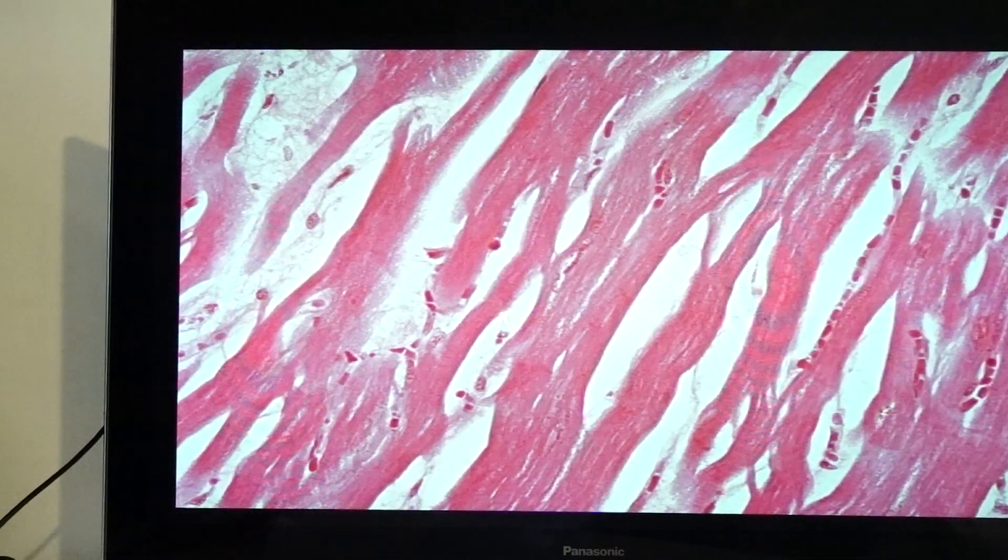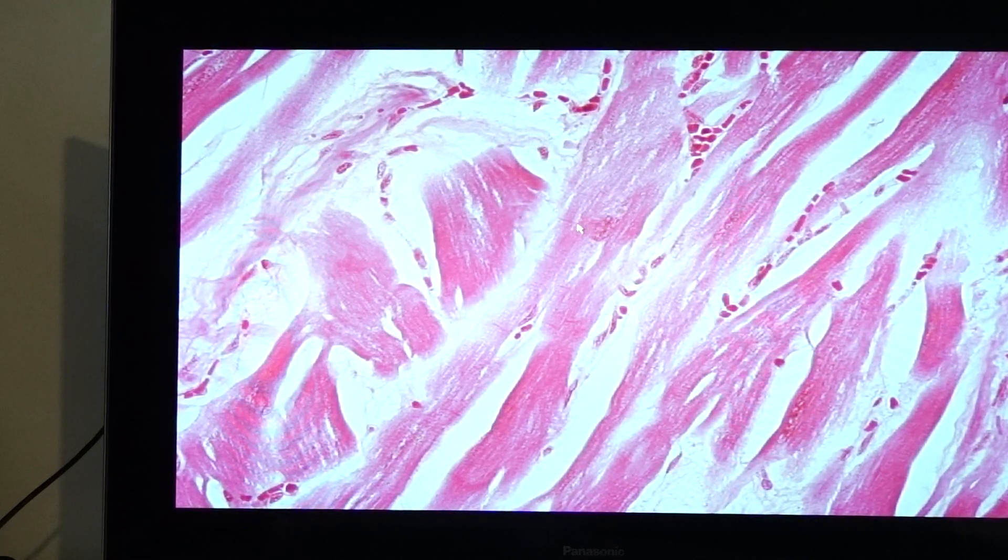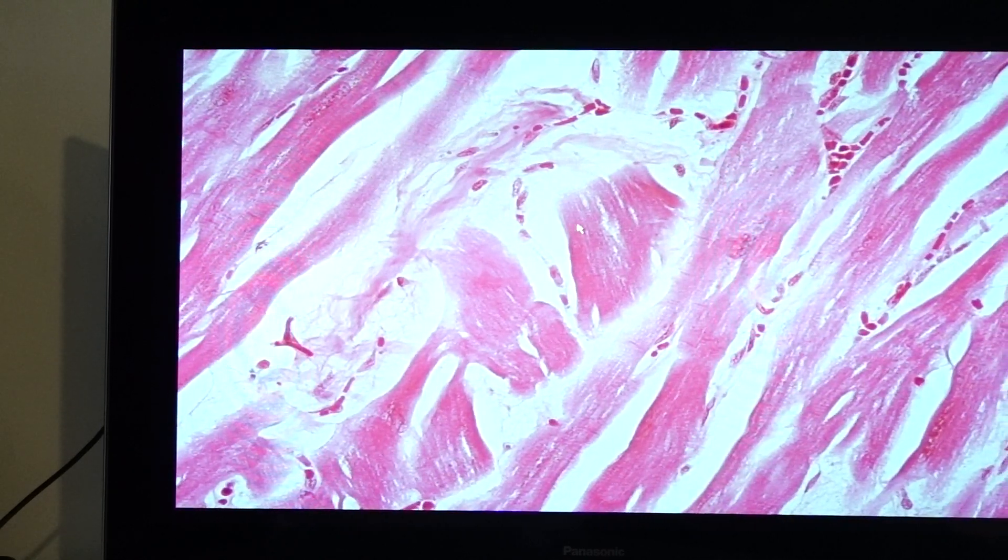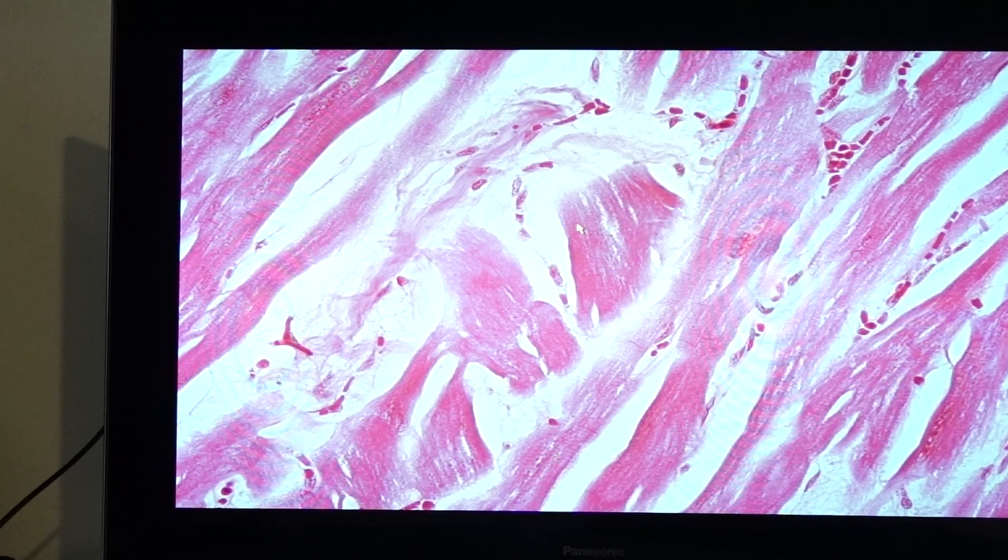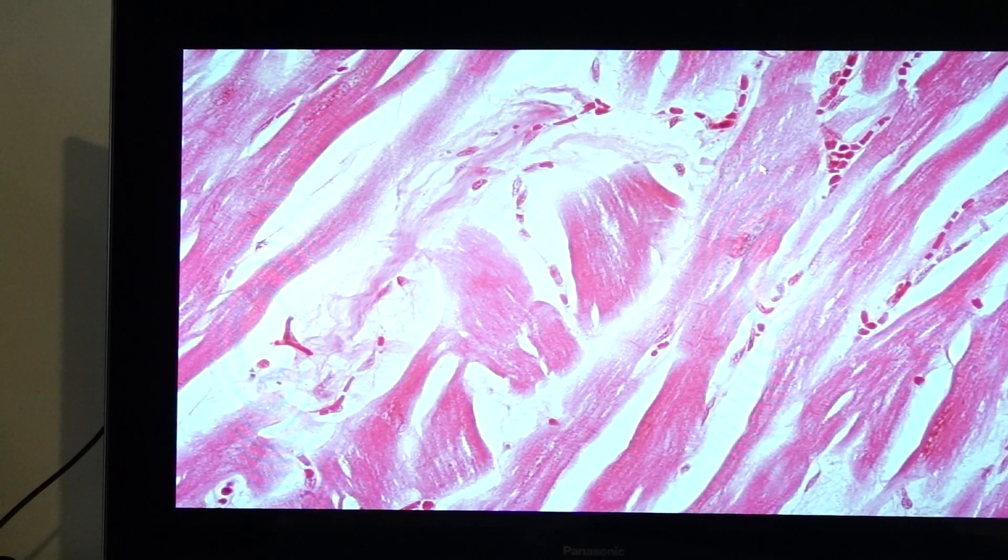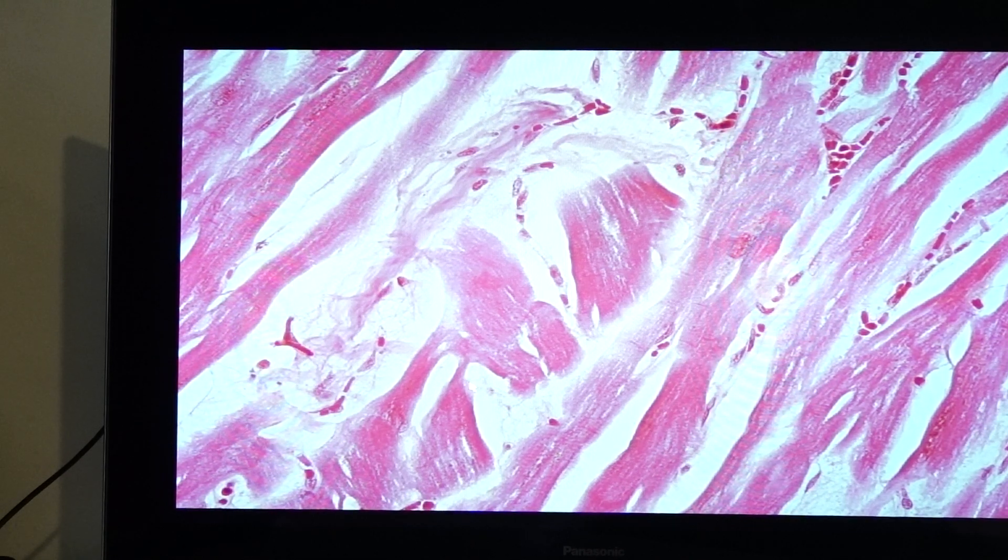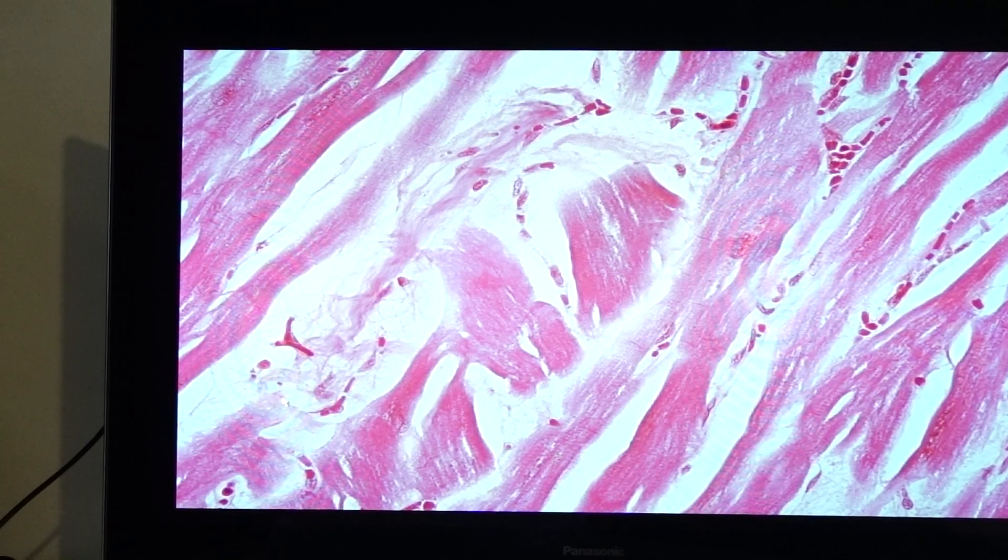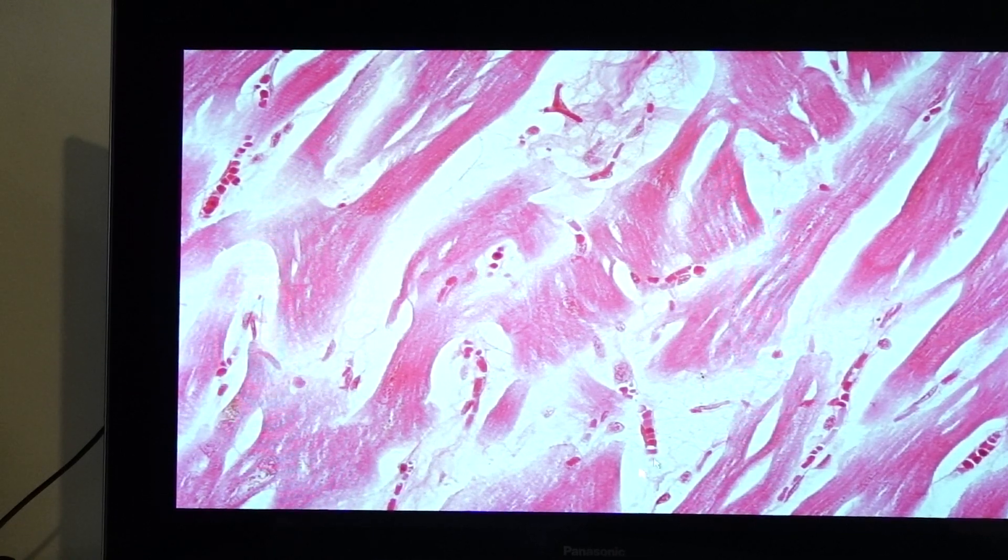Histologically, what we would see would be the presence of thickening of the myocardial fibers. You have the thickening of the myocardial fibers. Here, you have the nuclei. And then, what you can see is that there would be the myocardial disarray, haphazard formation of the cardiac myocytes. In this particular magnification, you can already see that there would be the presence of irregularly arranged myocytes, haphazardly arranged. Some are going obliquely, and some are going in this side.